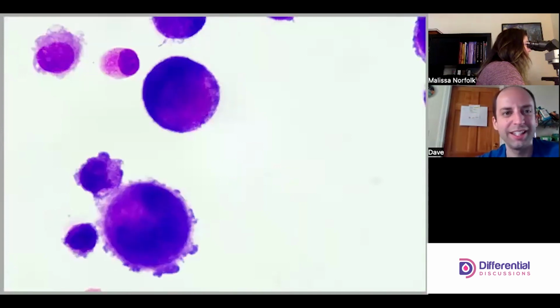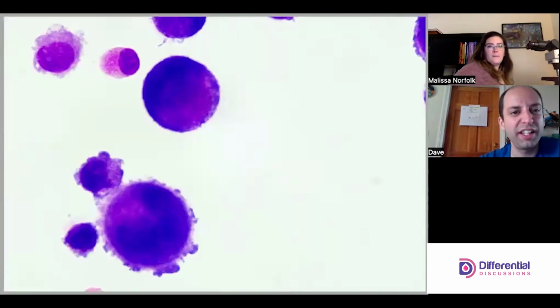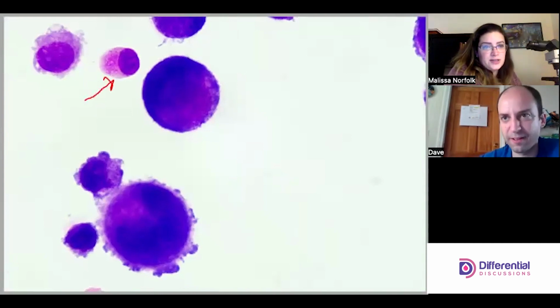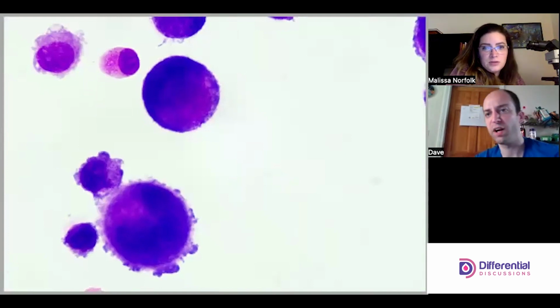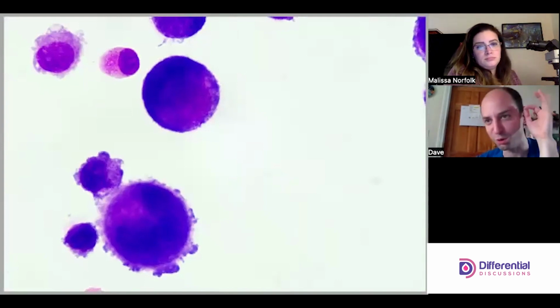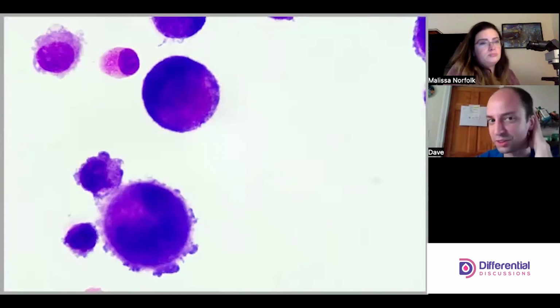Yeah, there are even these smaller cells. What the heck am I even gonna call that thing? I know. It almost has the same granular pattern as the last one that we looked at that had some cancer cells in it. Yep. So we had one other CSF that we reviewed that had less numerous abnormal cancer cells that had these kind of colored granules.